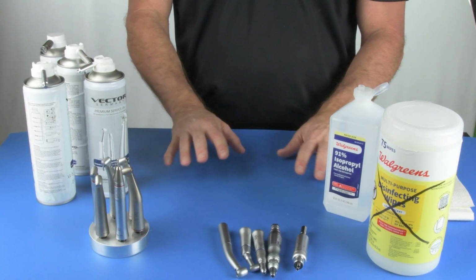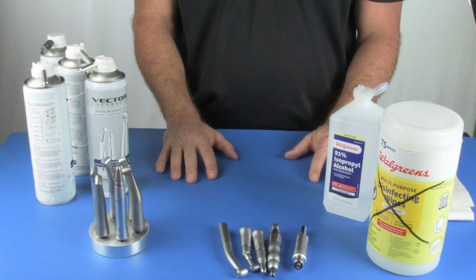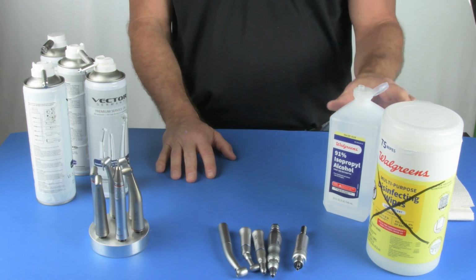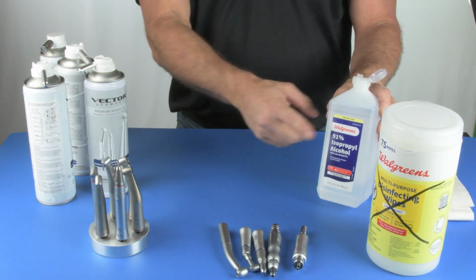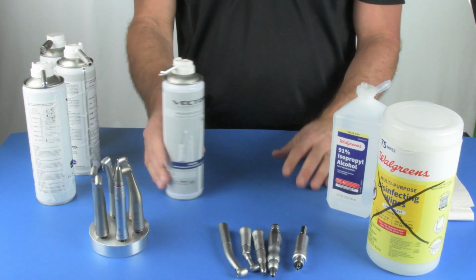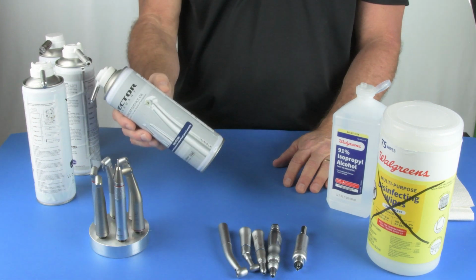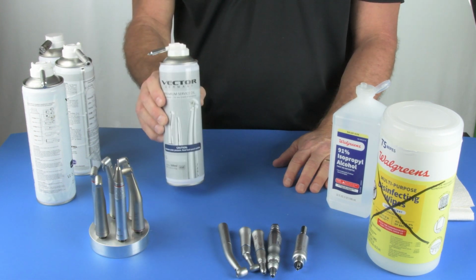Hello, we're here today to talk about handpiece lubrication and how to do it correctly. You're going to need a few things before we start. One of them is isopropyl alcohol, preferably 90%, and a quality lubricant like Vector Spray. This is what we recommend. Now, this is not the only lubricant out there, but it is the best one for autoclaving handpieces.